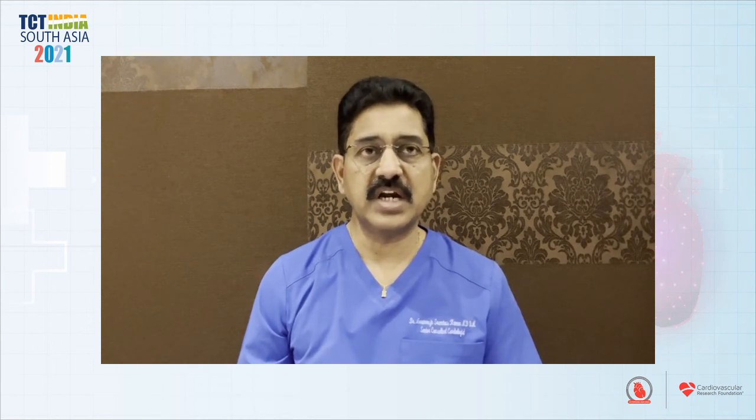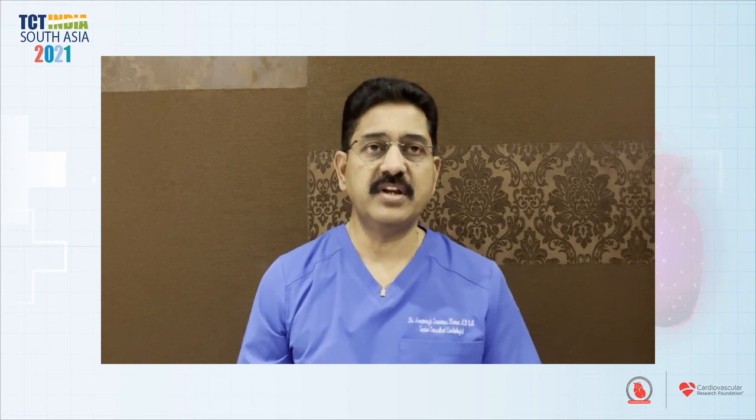We wish there will be more and more collaboration between adult interventional cardiologists and our pediatric cardiology colleagues, who are of great help even with complications that occasionally occur post-TAVR. All of us should become comfortable with the use of these plugs, because sometimes they can be used even for paravalvular leaks that can happen post-TAVR. There are instances where we close those defects using the same devices. Thank you, Dr. Nageshwar, for making this possible for us.